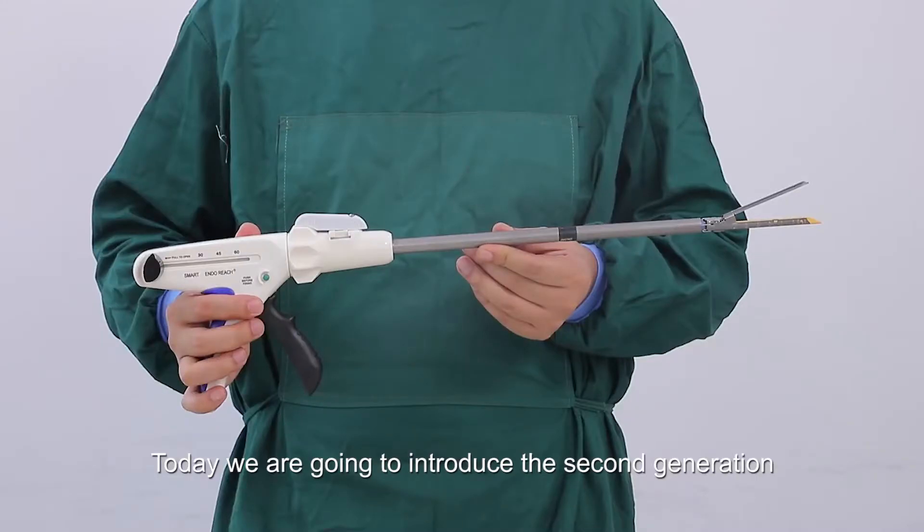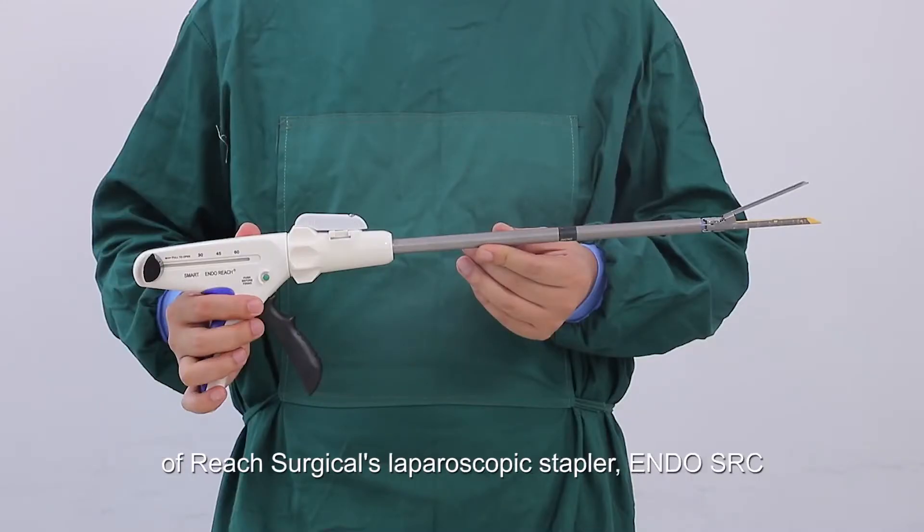Today we are going to introduce the second generation of REACH Surgical's laparoscopic stapler, EndoSRC.